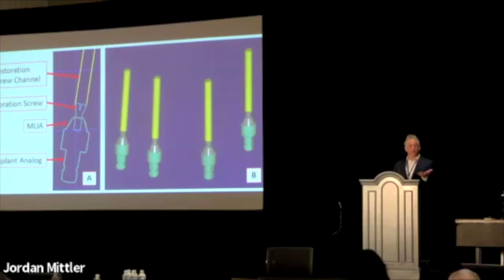And it's about, depending on the papers you read, about 40 microns in accuracy. Very accurate. Okay. And so now I know I can count on that to build upon. So that's all it does. It doesn't do soft tissue. It doesn't do anything else.